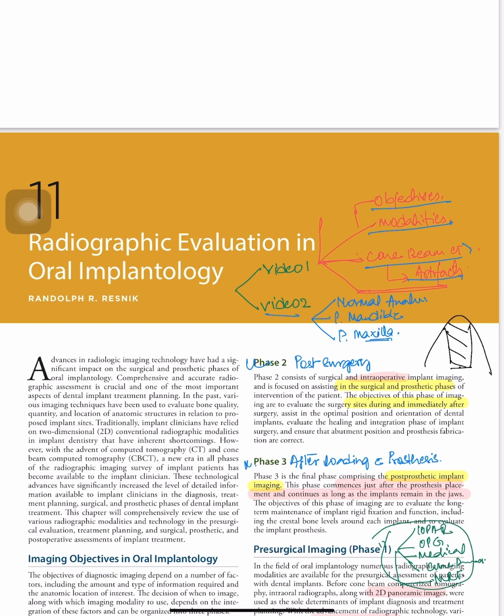Usually what happens is that patients compare the cone beam CT to a medical CT. They say, okay, medical CT has a lot of radiation, so will a cone beam CT have similar radiation? And that too for a single tooth. Why are you asking for so much radiation? In such cases, you can definitely explain to your patient that this cone beam CT has a lot less radiation exposure.